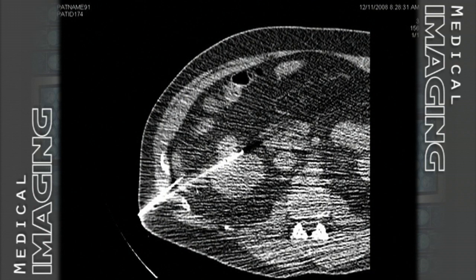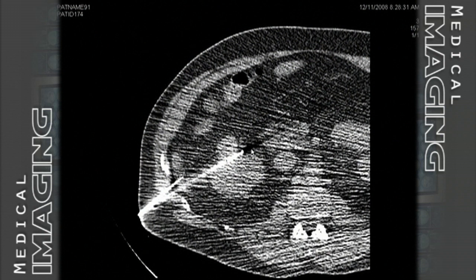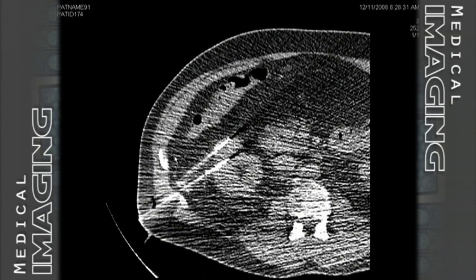Okay, here we see a second needle coming in using the first needle as a reference, and now we see this black space after the point of the needle. That indicates where the needle tip actually is. Here you see in profile both the first and second needles, and interspaced between the needle tips is the area of the suspected lesion or mass.